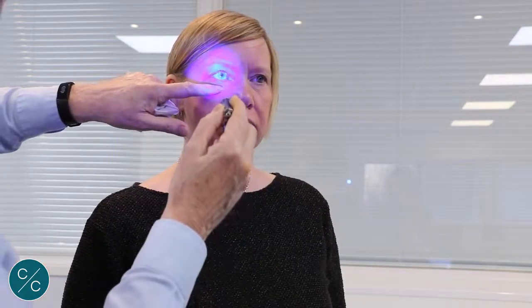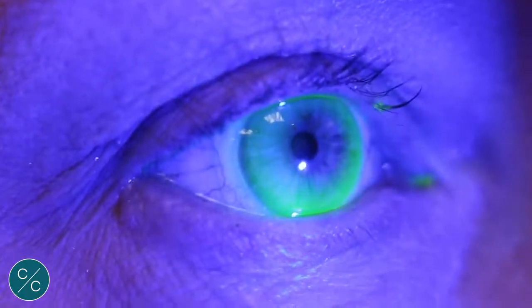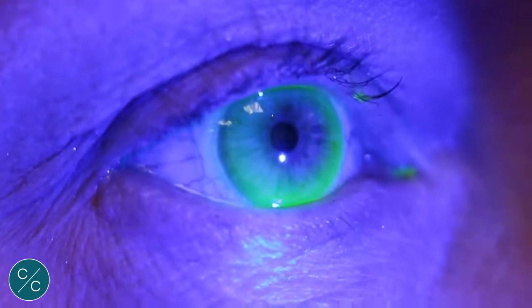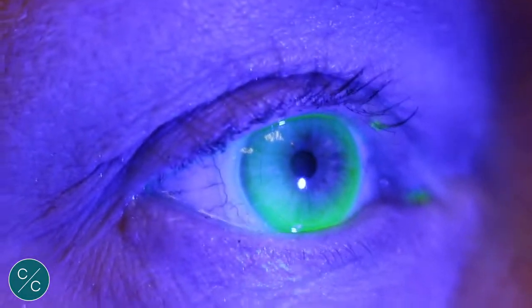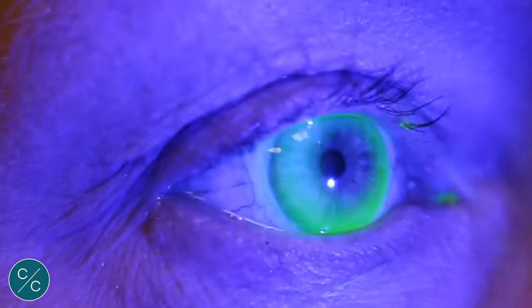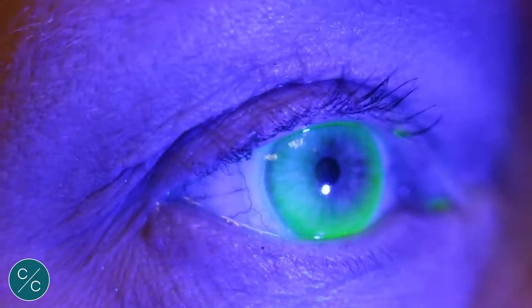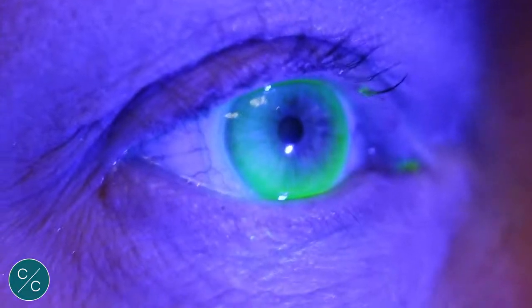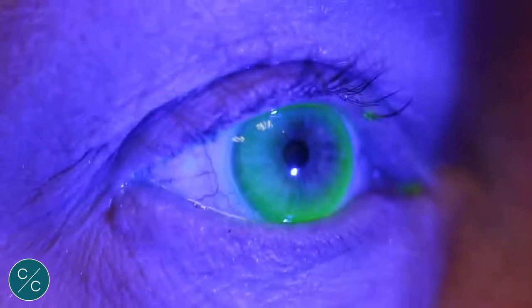The first check that we'll make is to have an overview of the lens to make sure there's no air bubbles and to have an assessment of the fit. So we'll take a UV light like so and we'll shine here. Now we can see, whilst there's no bubbles present, we can actually see there's very little central clearance over the centre of the lens. So in this case the lens is probably too flat and we're going to select another lens which is slightly steeper.